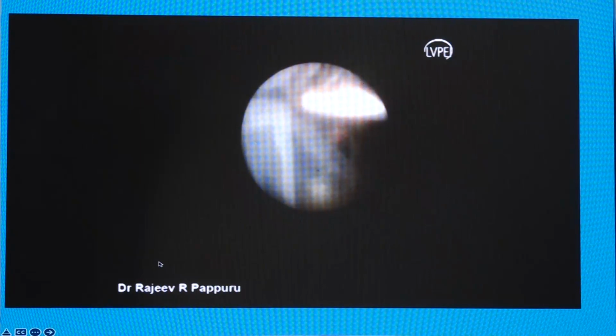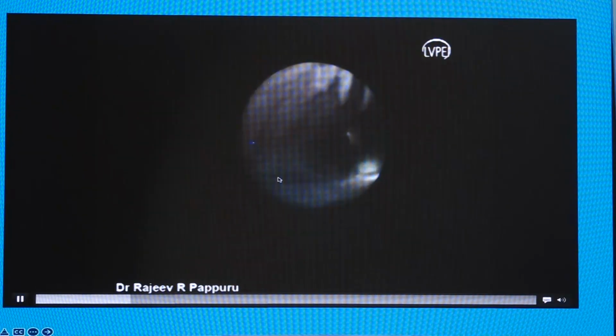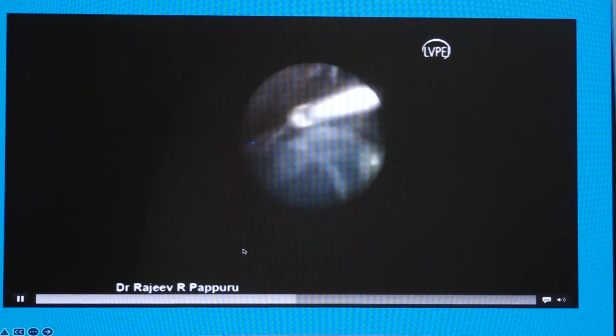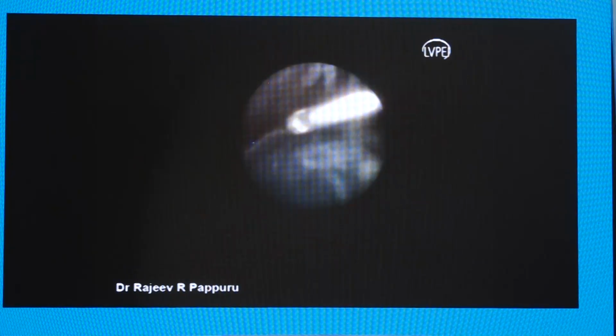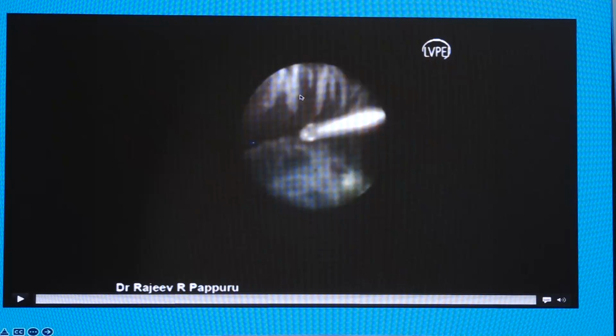So in terms of intervention, it allows us a visualization of what's happening to the ciliary bodies, and one of the most common causes of hypotony in these eyes is ciliary body membranes. So it allows us an assessment of these ciliary body membranes. It also allows us to remove some of these membranes. This was an eye with extensive peripheral membranes, and you can visualize this area and use a cutter to shave off and remove these membranes, which with a conventional system would have been absolutely impossible to assess. So you can see the ciliary body and some of these membranes which can be dissected.